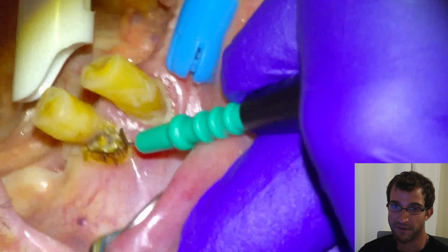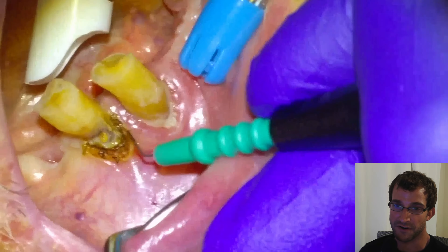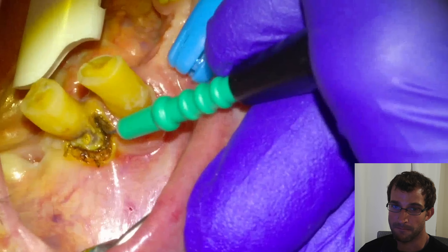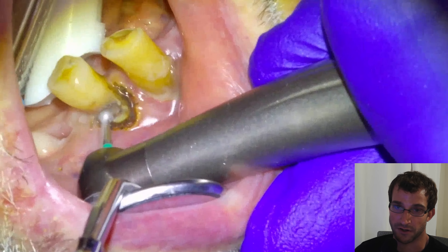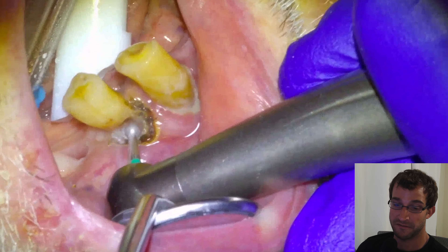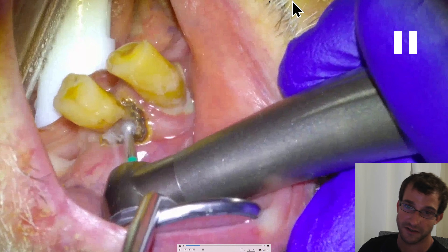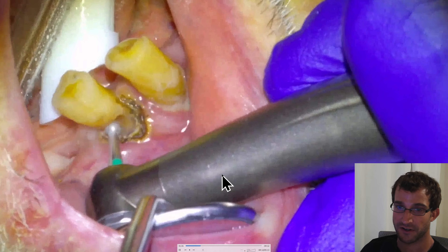We waited about five minutes before getting to work. For access, I don't think you'd ever be able to do a good filling on a tooth in a situation like this without either an electrocautery unit or a laser. I think that electrocautery is the superior technology for ablating gum tissue, even though lasers are newer and more expensive. I personally have had much better experiences with electrocautery units — look at the tissue, it does not bleed and it cuts so much faster. I don't know why people elect to use lasers honestly when electrocautery units are available.